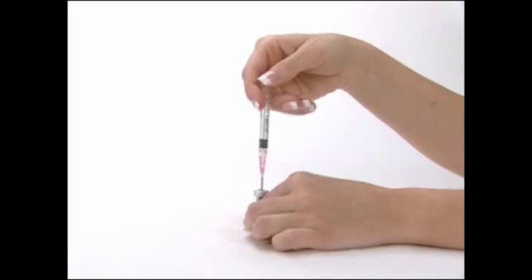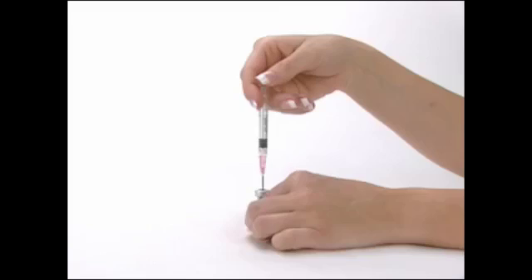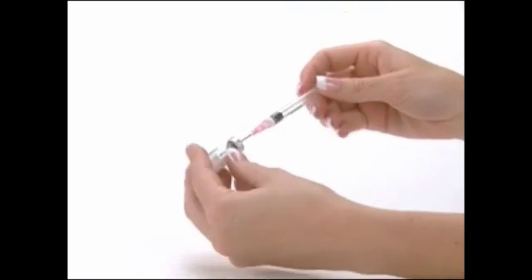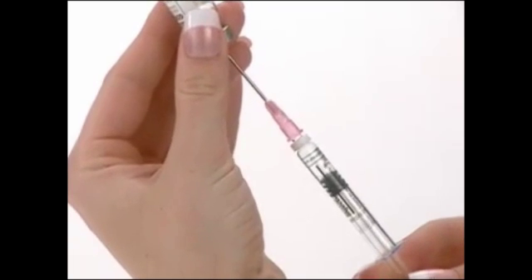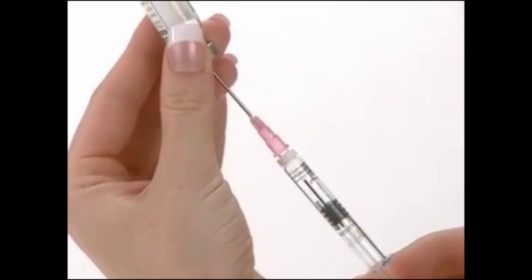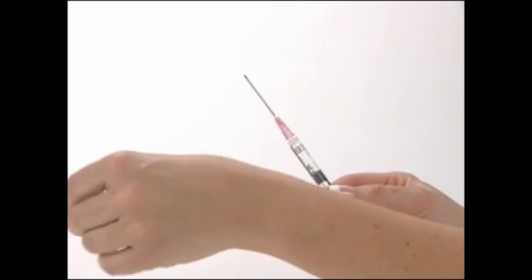Without removing the 18 gauge, 1½ inch pink needle, invert the vial and slowly pull back the needle as far as needed, and withdraw the entire contents of the vial into the syringe. Make sure the tip of the needle remains in the solution by slowly backing the needle out of the vial to withdraw as much of the solution as possible. Remove the needle and syringe from the vial.